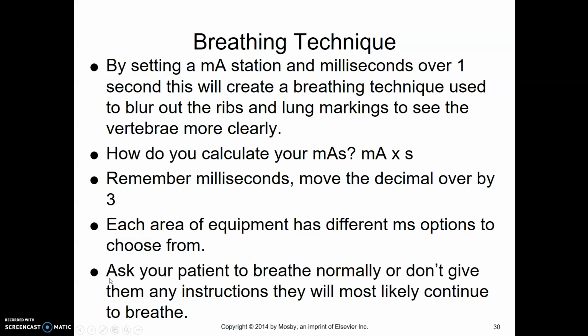I tell my patient to breathe normally if I think they can follow instructions. If they don't, then I don't say anything to them at all, and they just continue to breathe, and it works perfectly.